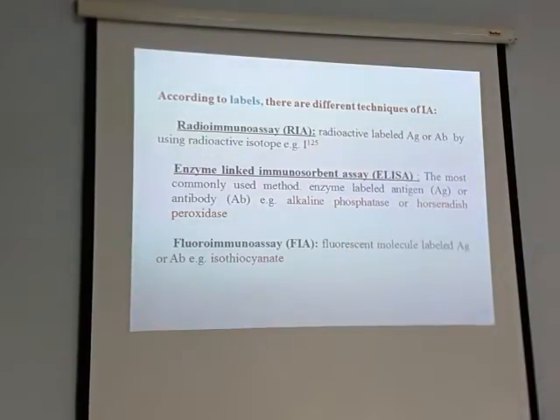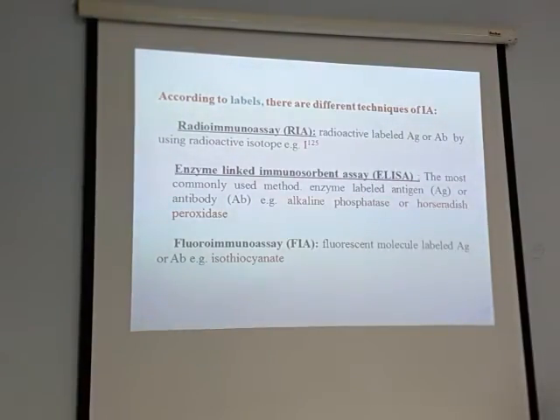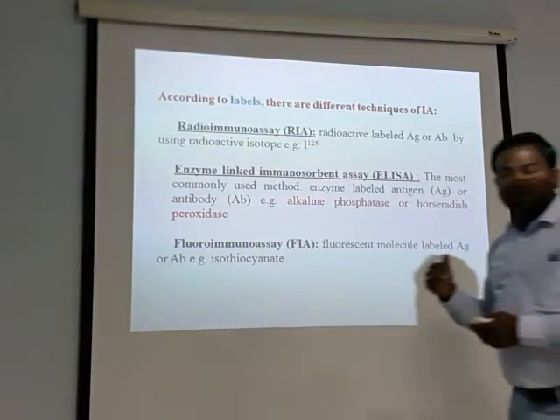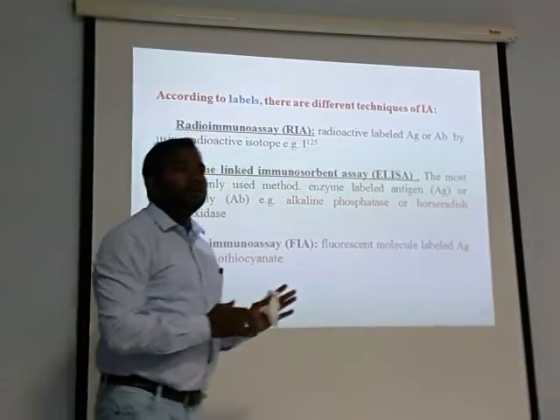But what are the main types? The four: competitive, non-competitive, homogeneous, and heterogeneous. These are the four main types. These depend on the labels which we are using in the test, and we divide them into radio, ELISA, and fluorescence. So far, is it clear? Yes.